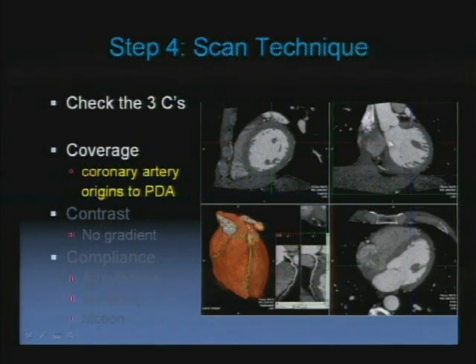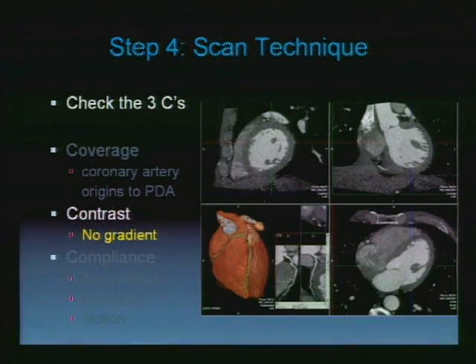So I will make sure that we've covered the left main coronary artery, as Sumita said, that tends to be the highest artery, and gone through the lung bases to make sure we got the PDA. But you know, coverage works both ways. If you over-irradiate the patient, for every 2 centimeters that you irradiate, you either increase or decrease the dose by 12.5%. So you've got to make sure that you're not scanning 20 centimeters, for example. So I think our default field of view is about 14 centimeters, just to make sure the patient hasn't breathed inappropriately during the acquisition.